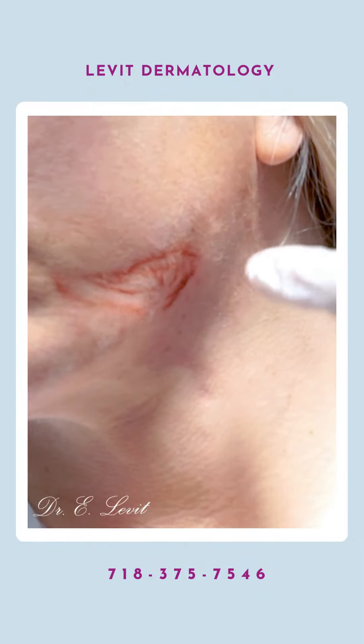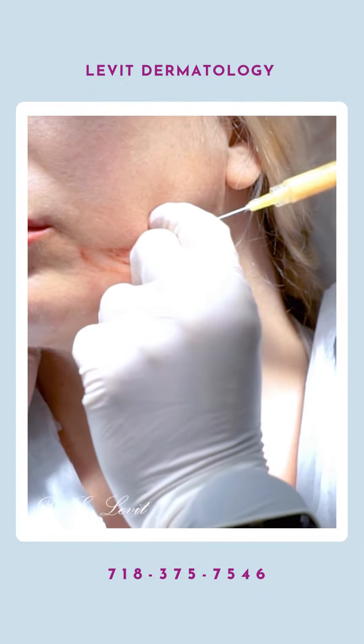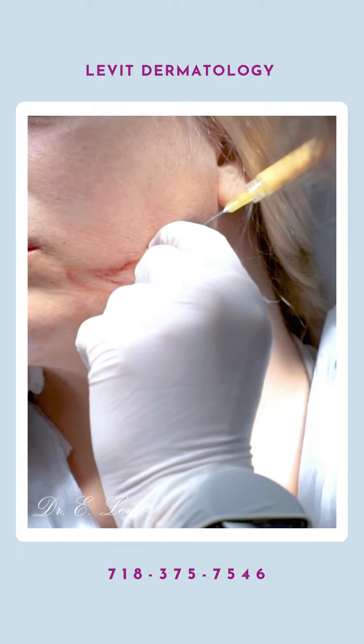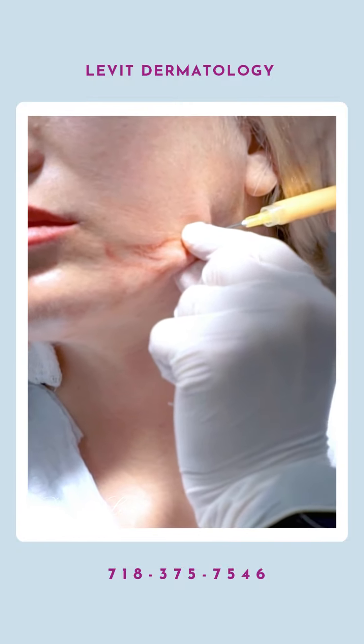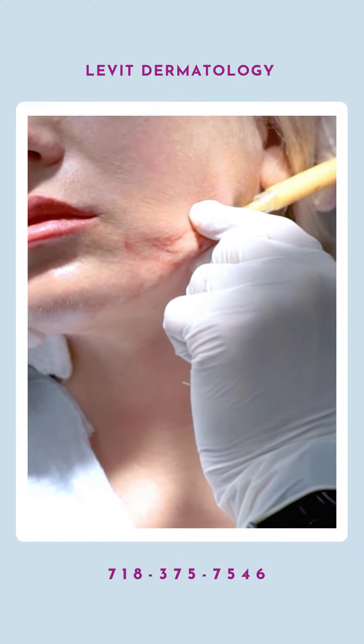We did a little anesthesia, small spot here. Not feeling anything? No. Good. Now we're going to lift it up — it's really scarred down. I can feel it being very scarred down there.